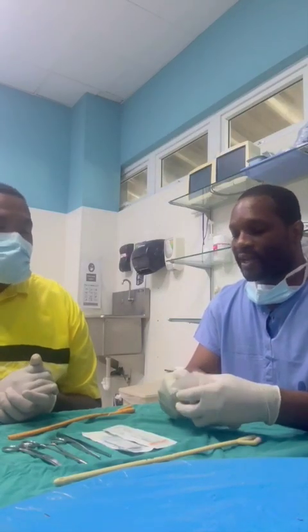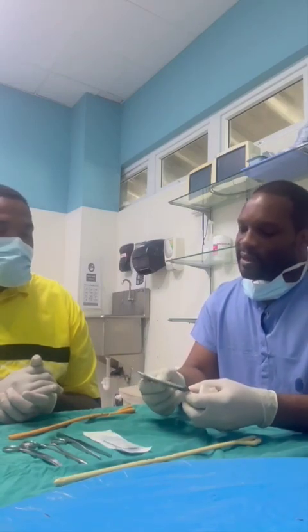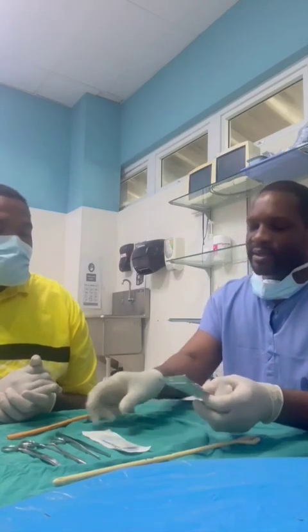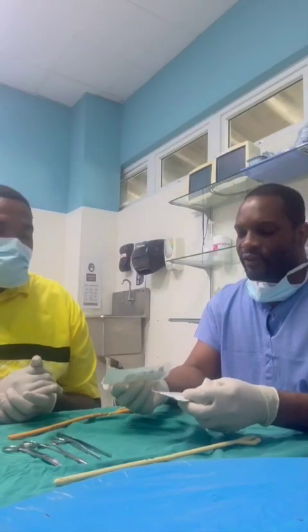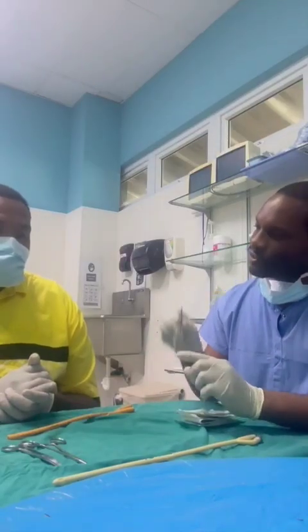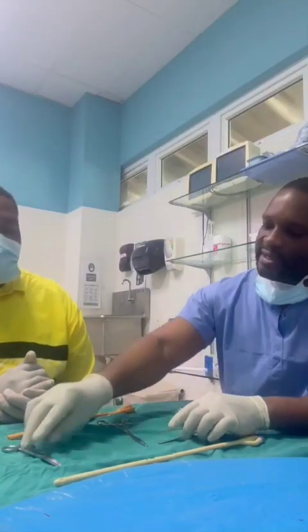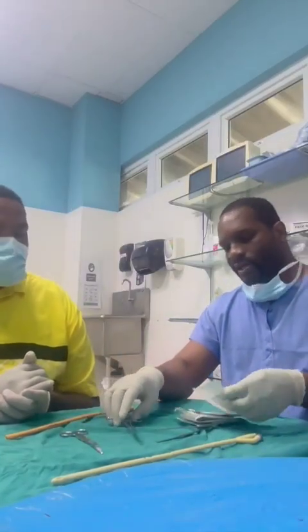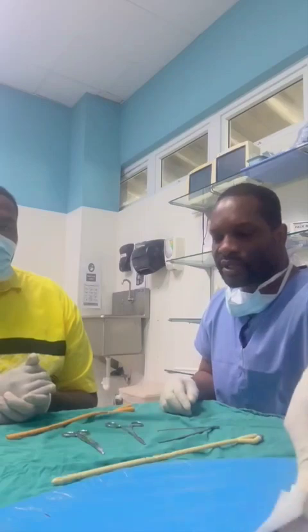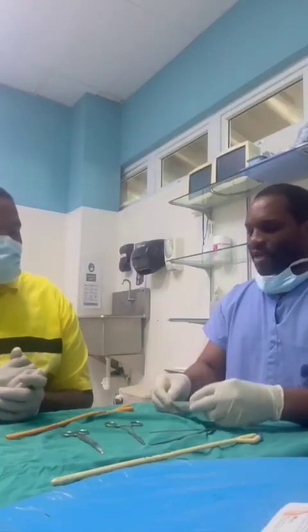With the polypropylene. Here we have a Monocryl, which is a monofilamentous suture, which you described. And here, this is a different brand of polypropylene. So today we'll be using the tissue forceps, and this is the needle holder. And these are scissors to cut. So let's start with the polypropylene. Can you see clearly? Yes. Comfortable? Yes, I'm comfortable. Very good. So they're at the appropriate height.